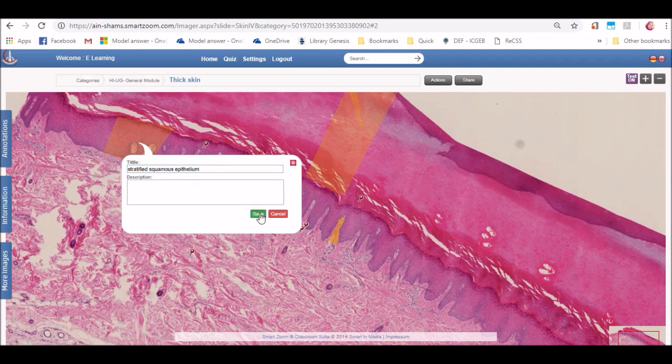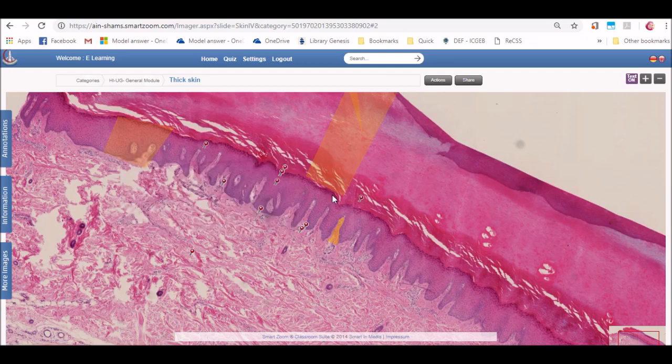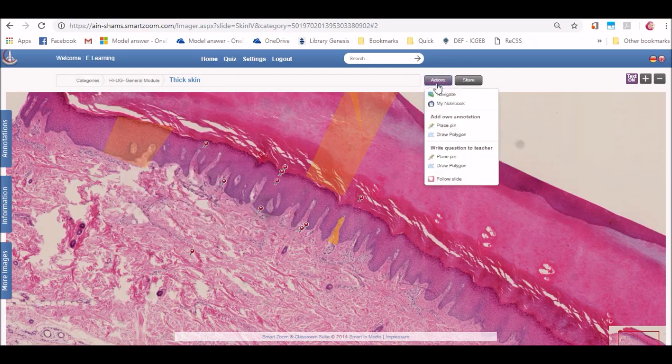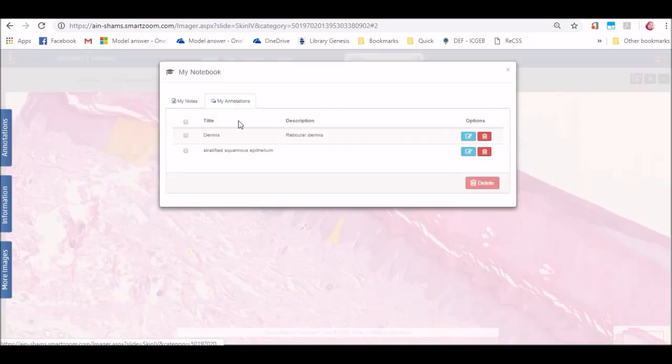And after adding all your annotations, you will find them all saved in your notebook. And in your notebook, you can edit or delete annotations one by one.